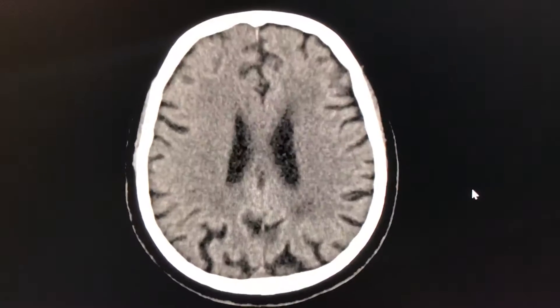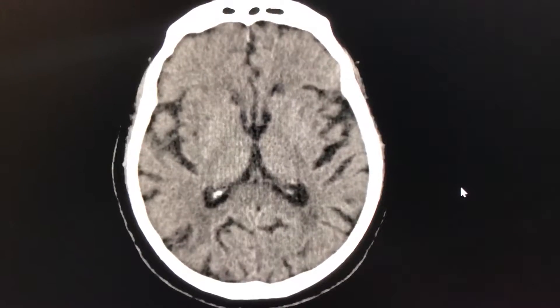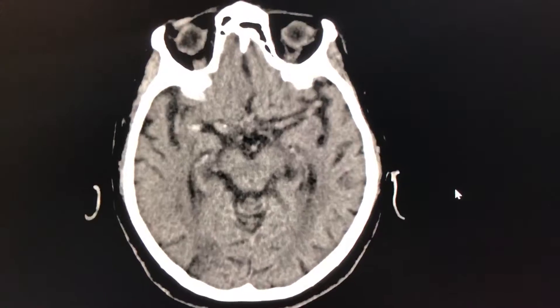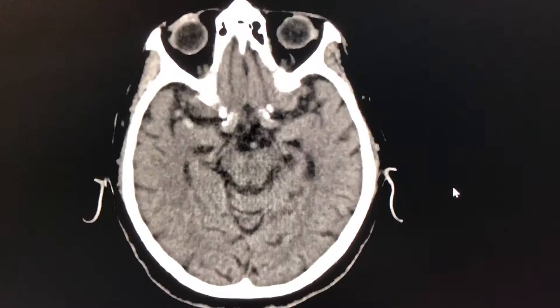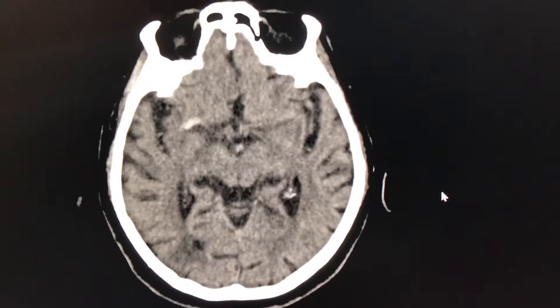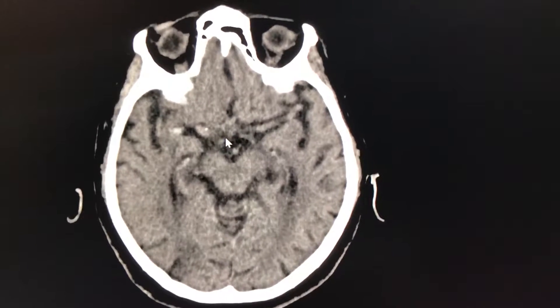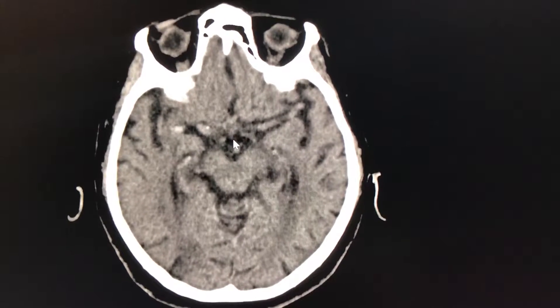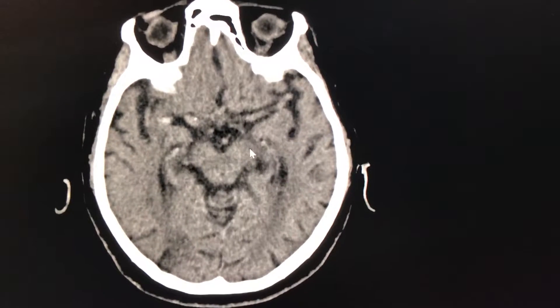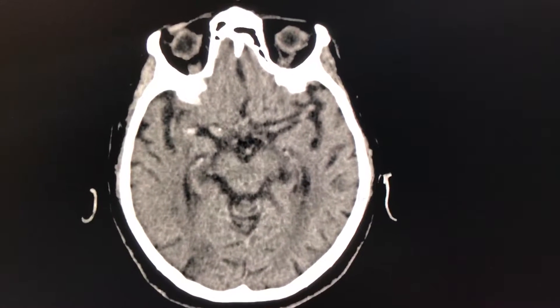This is a quick demonstration of a hyperdense right MCA sign. You see the hyperdense M1 segment of the right MCA, and you really compare it to the left side in order to avoid some of the false positives.